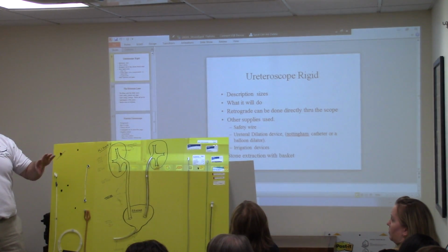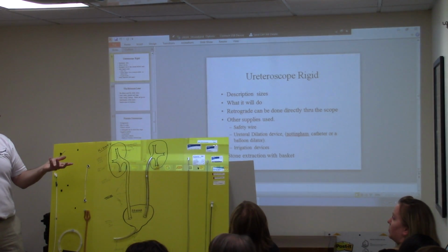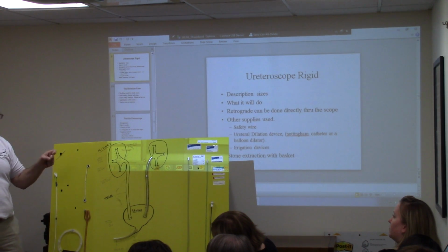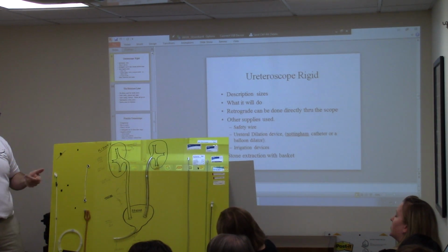Yeah, because that's why X-ray is used quite a lot, because you want to make sure you're hitting the stone all the time. If the patient coughs or something, that'll make it move. So you really have to be monitoring at all times. But, you know, the X-ray's not on all the time, it's just like a quick look, maybe a couple of seconds, and shut it off, take a look, shut it off.